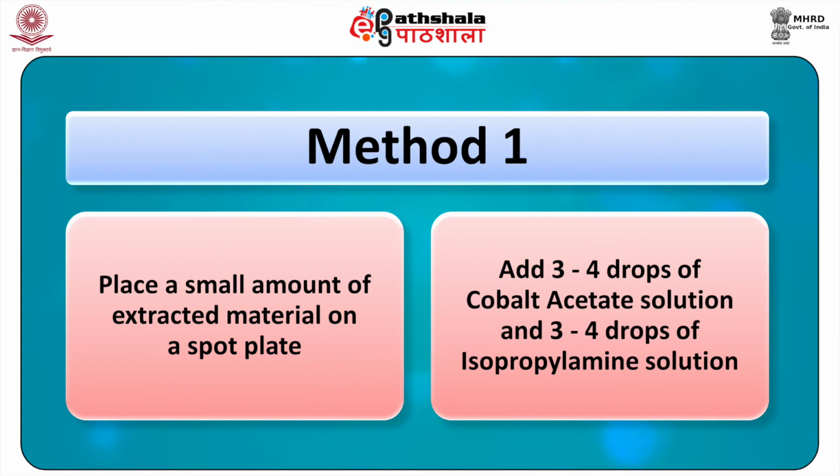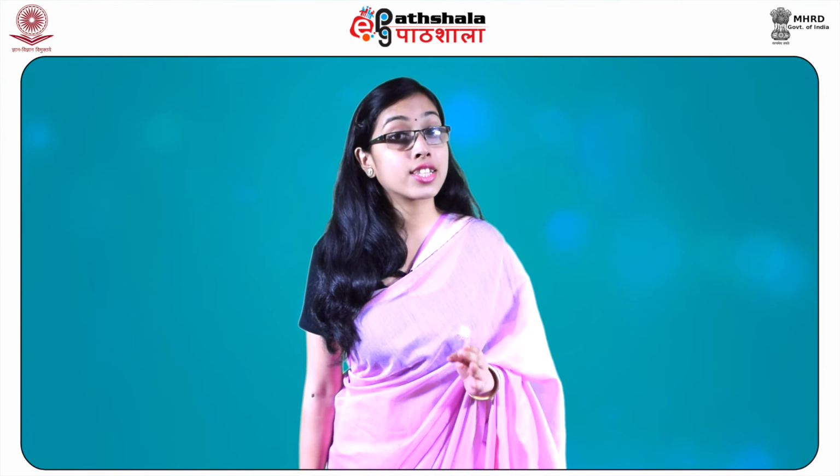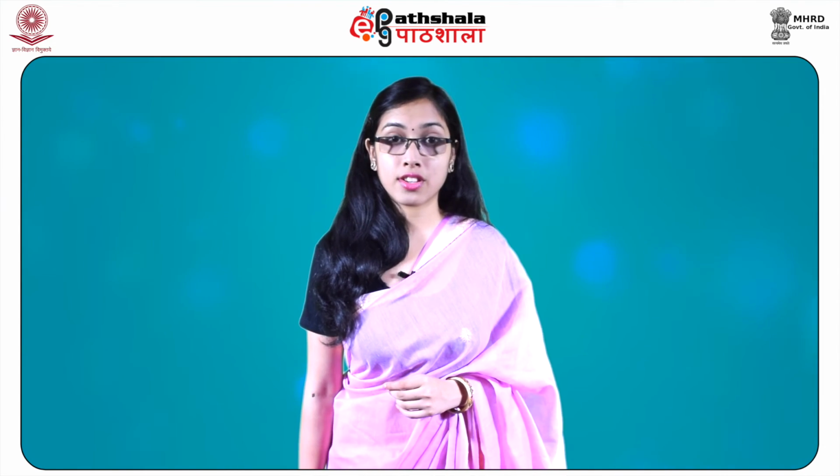For reagent 2, that is the isopropylamine solution, 5 ml of isopropylamine is mixed with 100 ml of methanol. Then we have 2 test procedures. Under method 1, a small amount of the extracted material is placed onto a spot plate. 3 to 4 drops of cobalt acetate solution and 3 to 4 drops of isopropylamine solution are added. The appearance of a purple or blue-violet color indicates the presence of barbiturate.